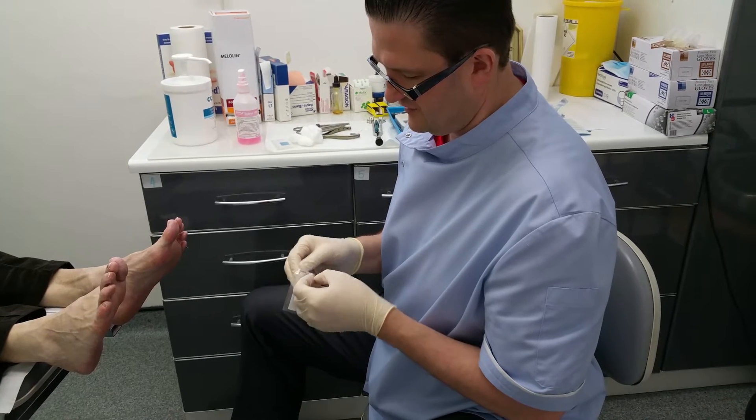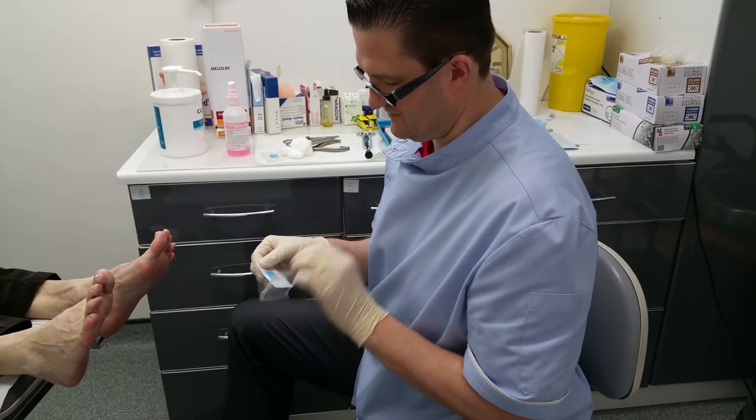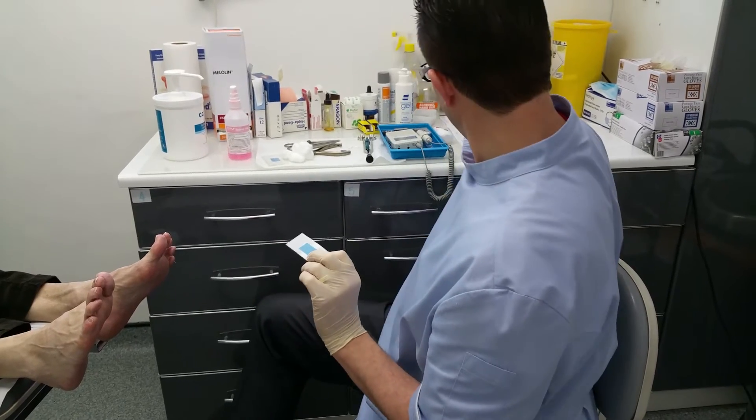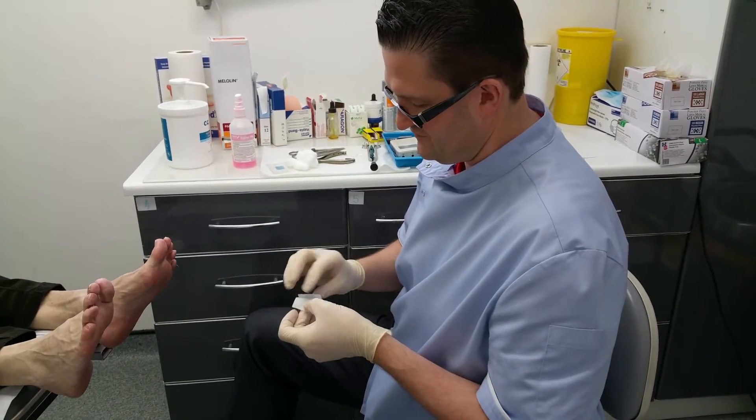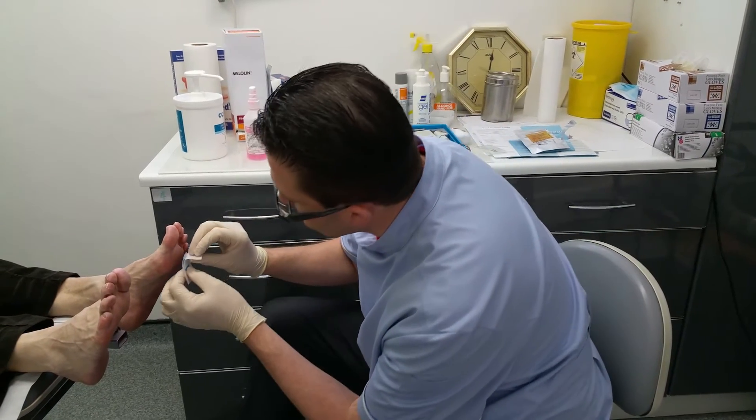There's one for each foot and what I need to do is make sure it is blue — it needs to stay blue. If I was to be holding this with my hand, the sweat on my hand — I do have sweaty hands — would make it start going pink straight away. So we're going to put it onto the foot here.